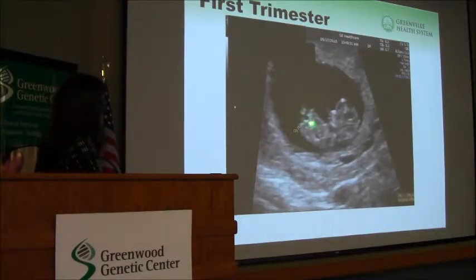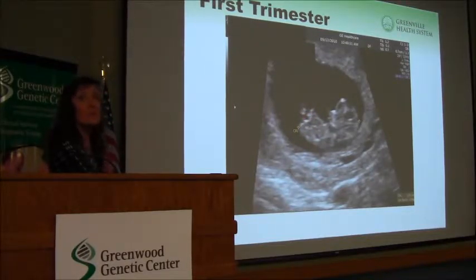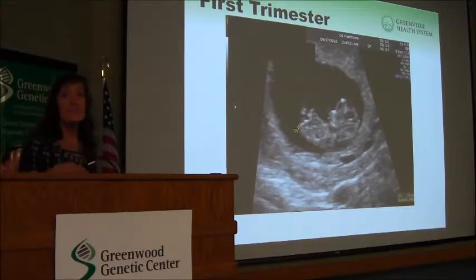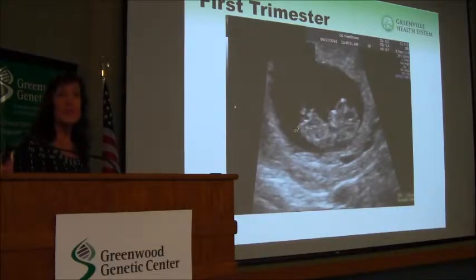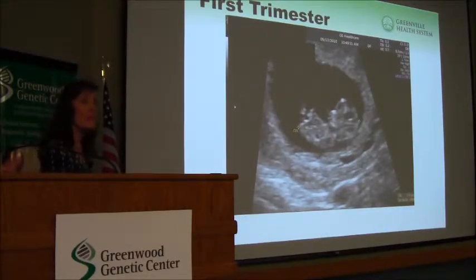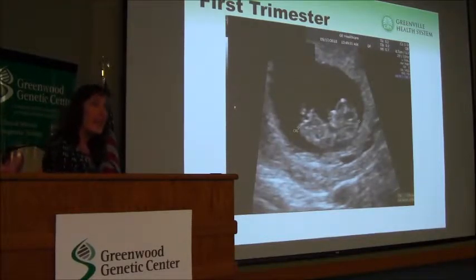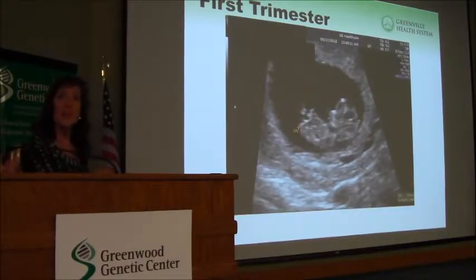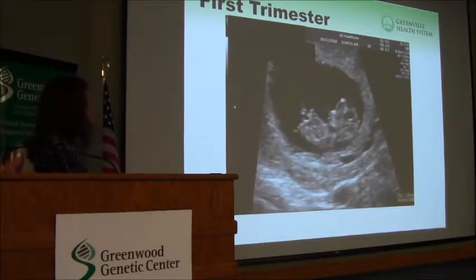I put this here to remind me that this is the abdomen, to remind you of something that we frequently get consultations on. Is there a ventral abdominal wall defect? But there's a process of physiologic mid-gut herniation that occurs in the first trimester between 8 and 10 weeks of pregnancy, where the intestine enlarges and elongates and goes into the base of the umbilical cord. And then as the abdomen continues to grow, it goes back intra-abdominally. But we frequently get asked this in the first trimester, and this is just an embryologic normal finding.